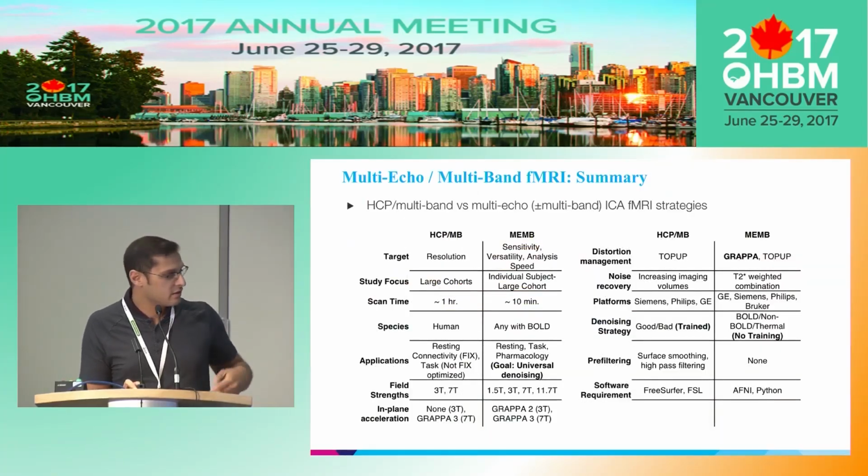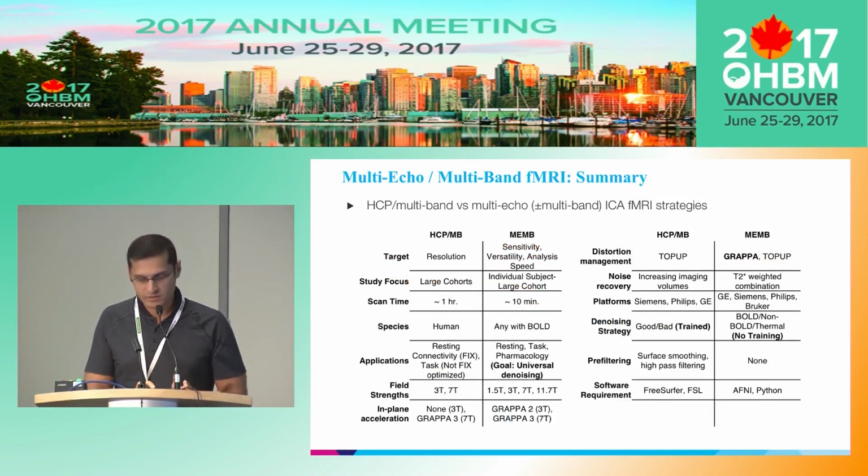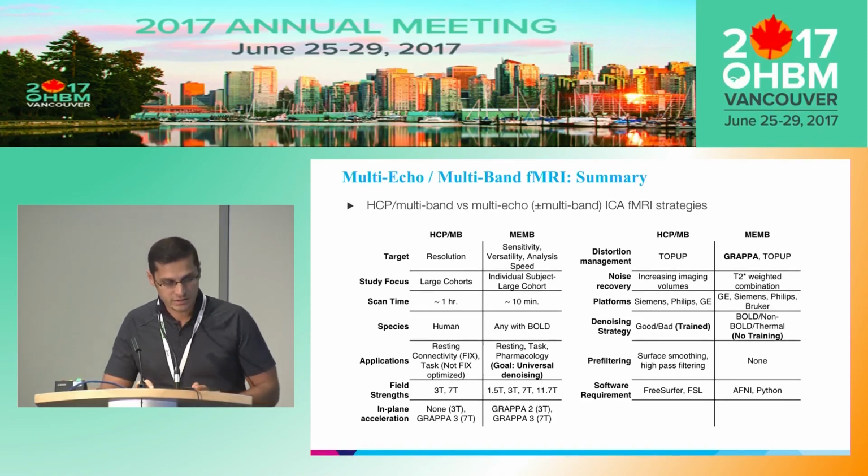Okay, so just a kind of comparison of ideas: the HCP approach versus the multi-echo, multi-band approach. The HCP approach is focused on resolution. They push to 2 millimeter, 1 millimeter resolution when they can. The multi-echo, multi-band approach tries to go towards sensitivity, tries to go towards versatility.